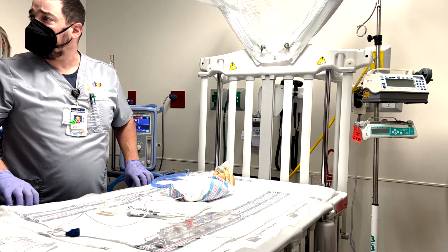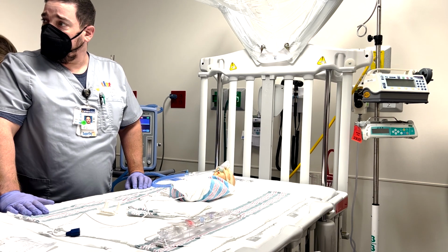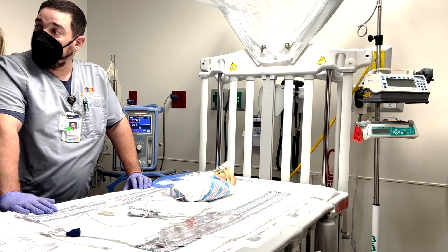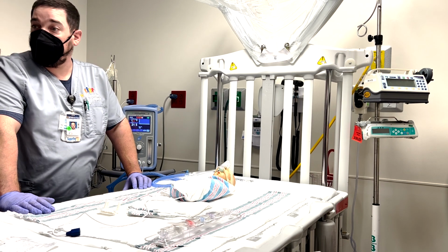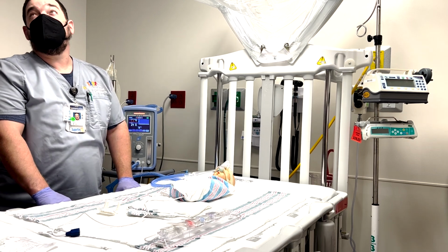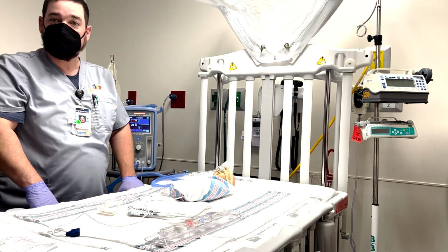What else am I missing, Joe, from our meeting? I mean, my immediate question is, is there anything that we can do to prevent the irritation, besides changing it out? Like, what if we see that this baby's skin is really breaking down? Okay, we can use Duoderm, or option B, depending upon the size of the infant, you can also go to, and this is one of those situations where I've really got to consider maybe a Trilogy and use it with the full face headgear, where they look like they're wearing the Scuba Steve mask.